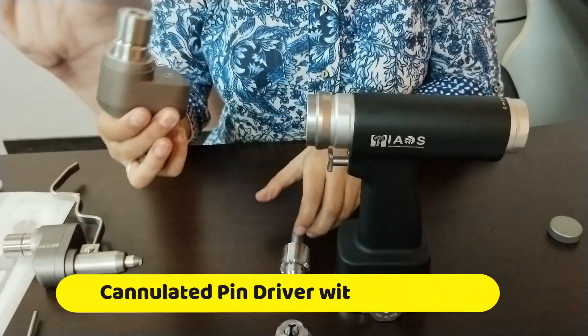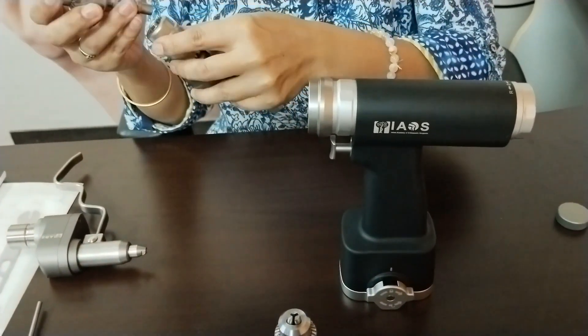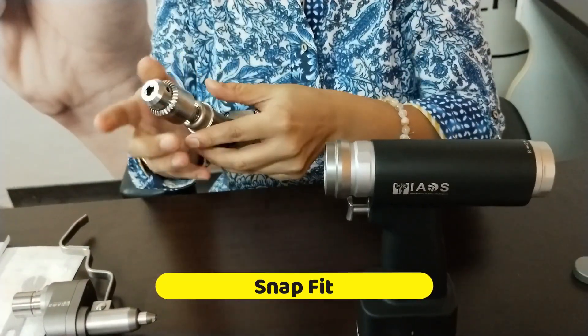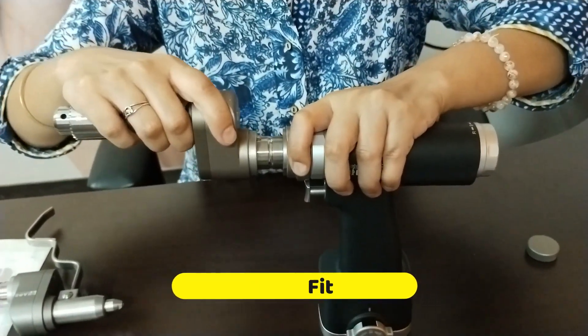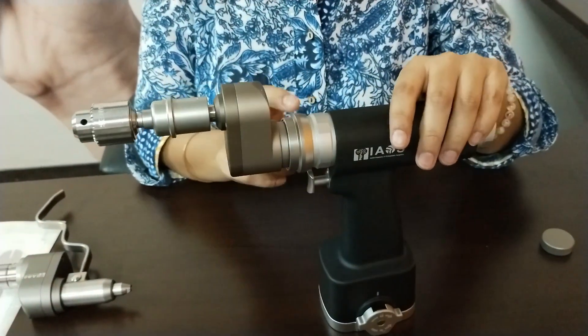The next attachment is the cannulated pin driver with an AO chuck. You just pull back the chuck lock with one hand, insert the cannulated pin driver, and it's a snap fit.